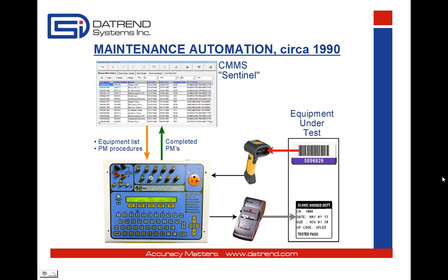Safety tests and other tests, such as defib energy, execute automatically as a pre-programmed sequence of measurement steps. The pass, fail, data entry, and the measurements are recorded, and they're saved in the med tester's memory. When the checklist is finished, the med tester produces an inspection label by means of an attached label printer, which is then put on the equipment.